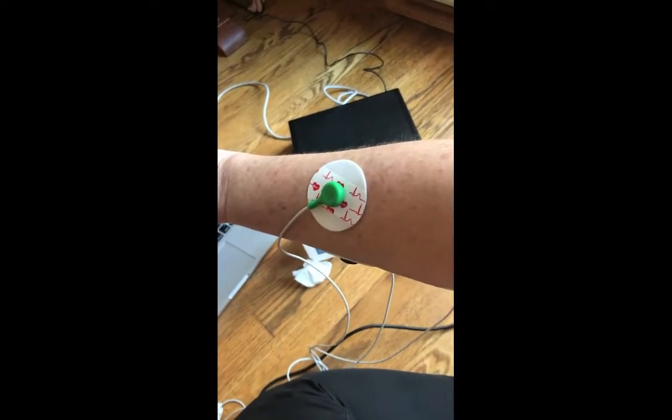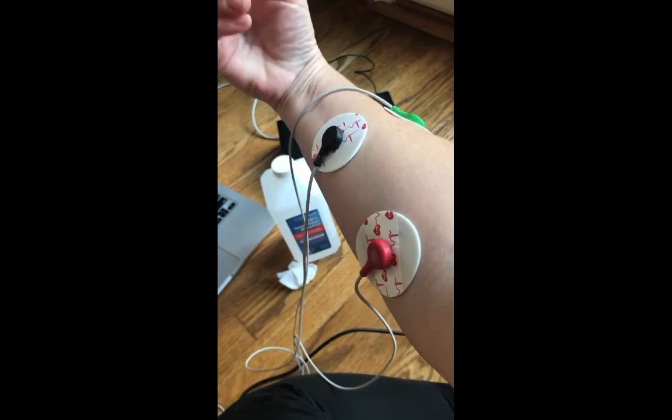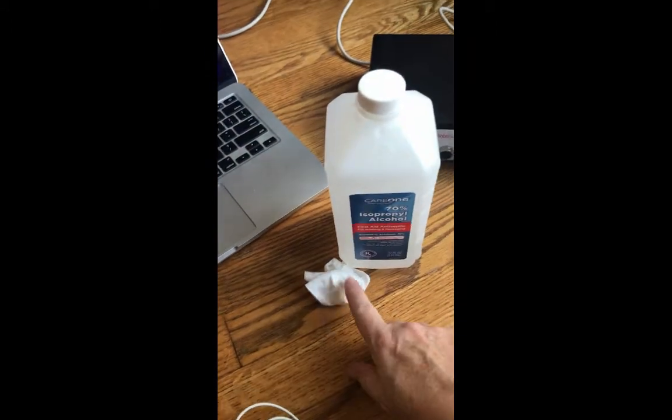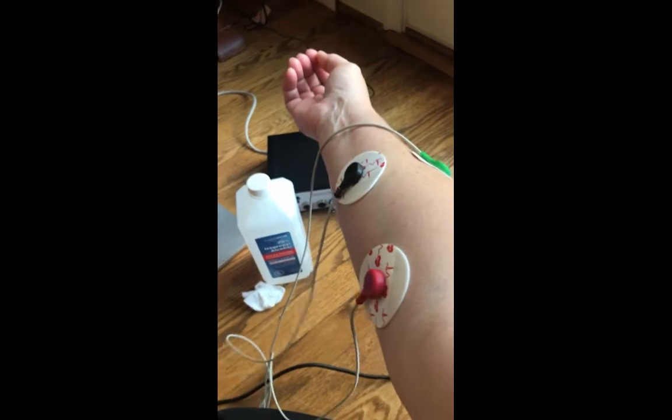I've got my electrodes on. Here's my green ground electrode. I have my red and black electrodes on my anterior forearm — I'm going to measure EMG activity of my flexors. Make sure that you clean your skin off really well with alcohol before you try to take any measurements.